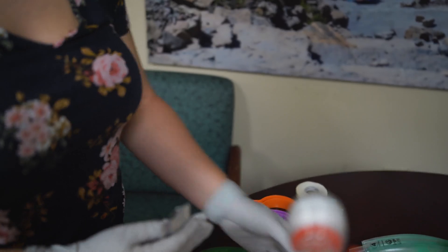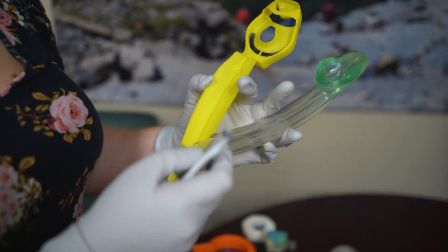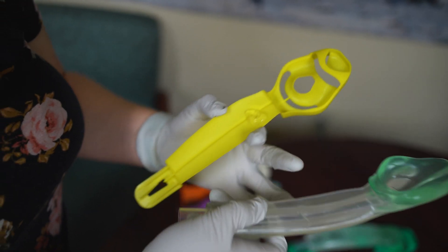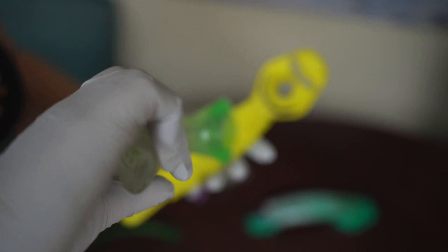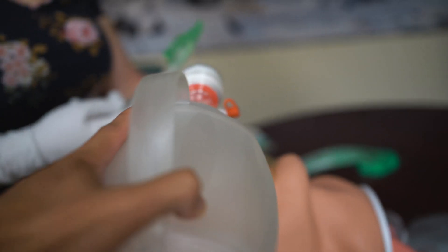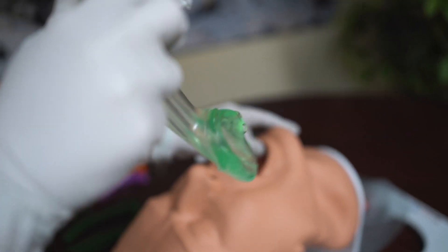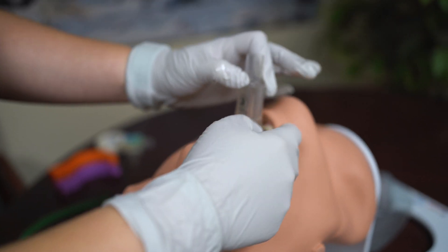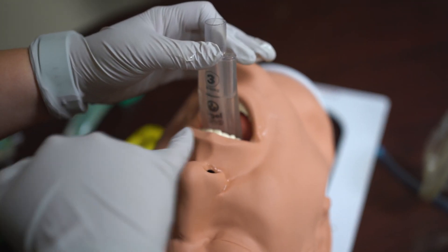Once I have the i-gel open, I prepare the lubricant. I hold the yellow piece, remove the i-gel keeping it as sterile as possible, and apply lubricant to the divot, lubricating the colored part — in this case the green part — all the way around. When I'm ready, I'll ask my partner to remove the OPA straight away. I use the scissor technique to open the airway and insert the i-gel until I feel resistance, making sure it's on the bite block — the hard plastic that goes beyond the patient's teeth.